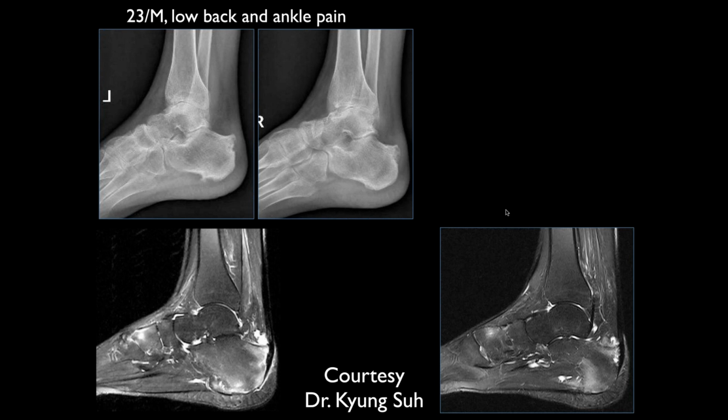With infection, you deal with pus. Yeah. If you see something that you know is an abscess, then you're absolutely right, John. You've got to really think about infection rather than a psoriatic dactylitis. Absolutely, you should not see a big fluid collection in psoriatic dactylitis. It's just diffuse soft tissue swelling, right?